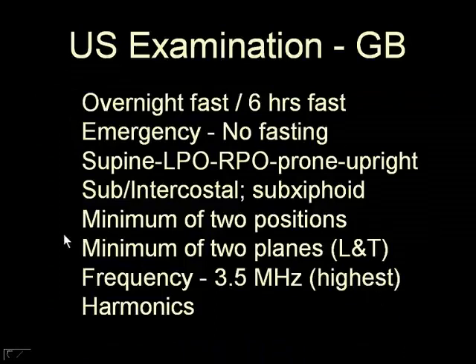We are not going to go into this, except I have to stress that we have to examine the gallbladder in a minimum of 2 positions. Every gallbladder we do has to be examined in a minimum of 2 positions and a minimum of 2 planes, longitudinal and transverse, definitely.